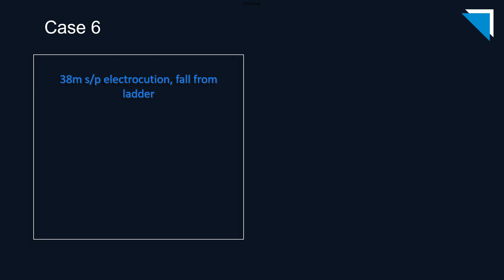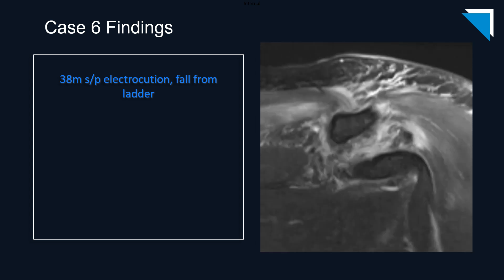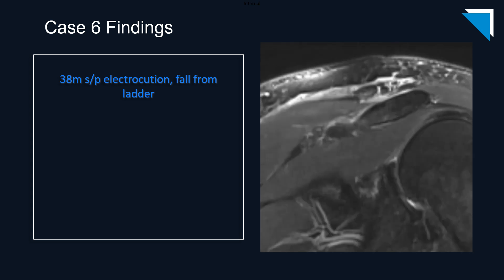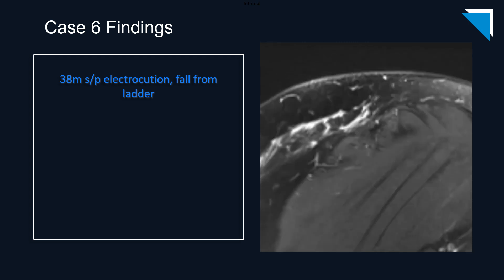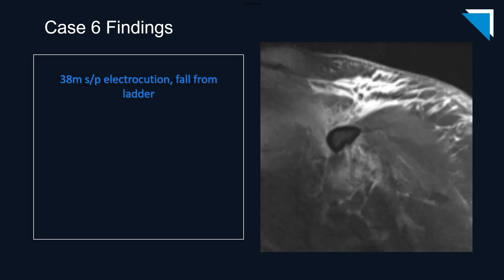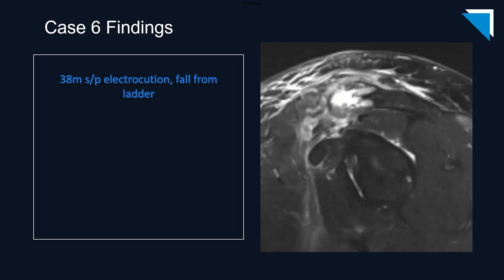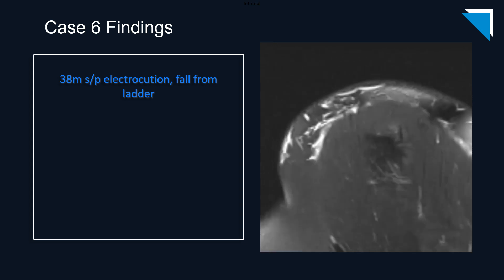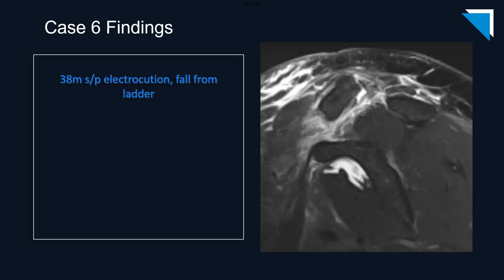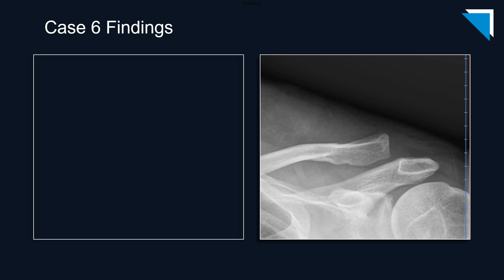Our last patient is a 38-year-old man status post electrocution and fall from a ladder — he's having a terrible day. We begin with a single plain radiograph, followed by an MRI. These are coronal fluid-sensitive images, and here is the sagittal fluid-sensitive sequence. Returning to our plain radiograph to review the findings.